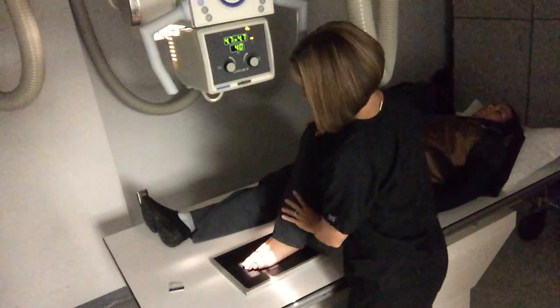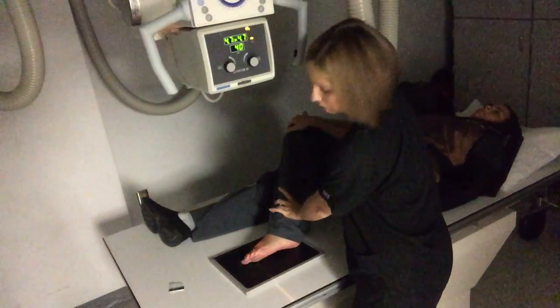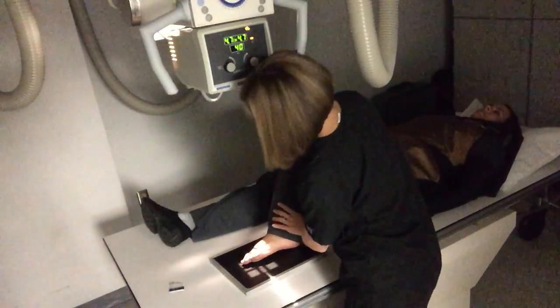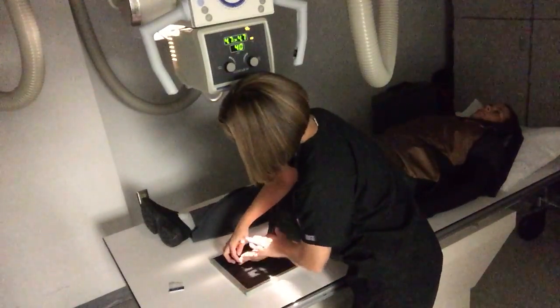For the oblique toes, you're going to have the patient roll their foot in medially about 30 to 45 degrees, and you're going to try to get them to separate these toes out, but most people aren't able to do a great job of that.